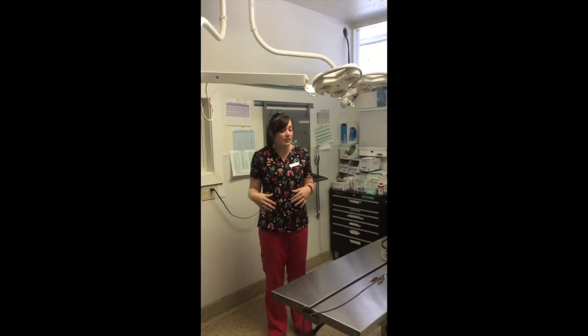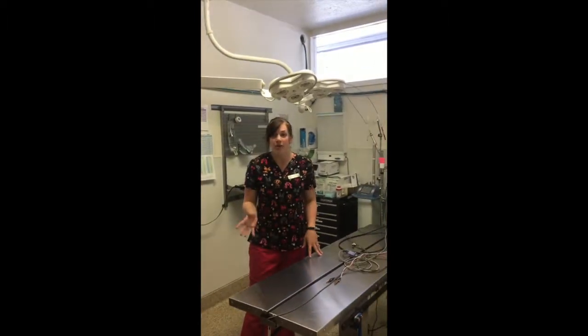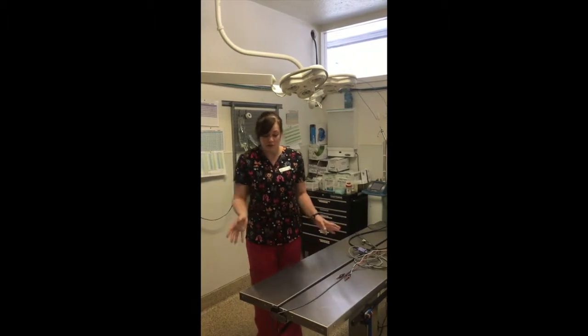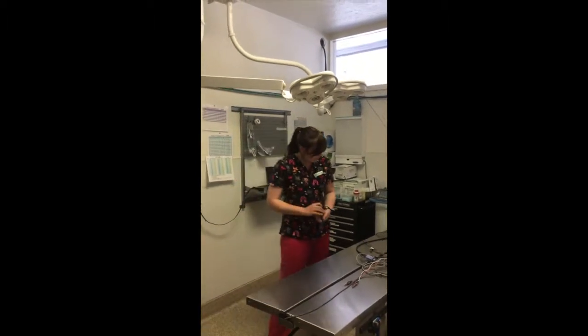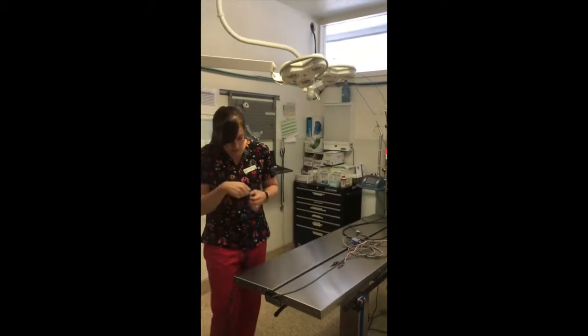To clean up a surgery suite after you're done with the day with all your surgeries, how to wipe everything down and put away your instruments, what you do with hazardous waste material, and sharps. So first of all, I'm going to go ahead and take all of our monitoring equipment and restraint equipment and put it away.